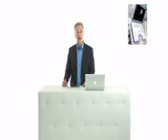This is Frida. Frida is 72 years old, and she tripped over a carpet and broke her leg. She was brought to the emergency ward, and a young attending physician did the pre-operative examination and found out that there was a faint murmur. Now, the anesthesiologist saw the patient and ordered an echo. We did an echo, and this is the study.